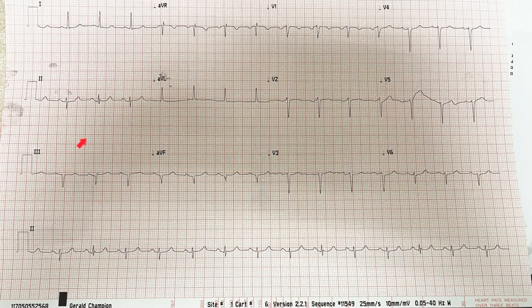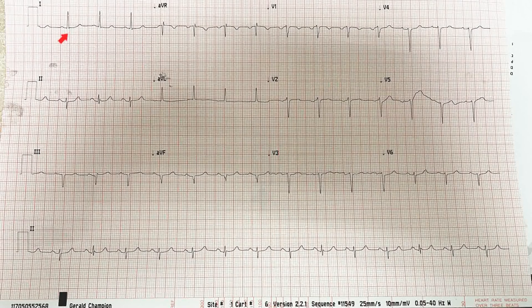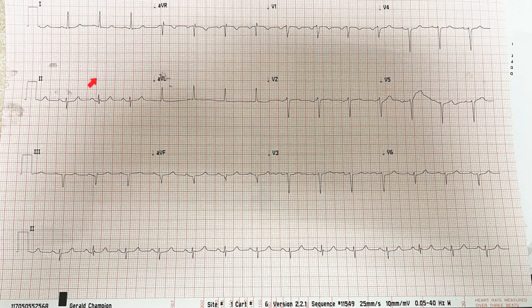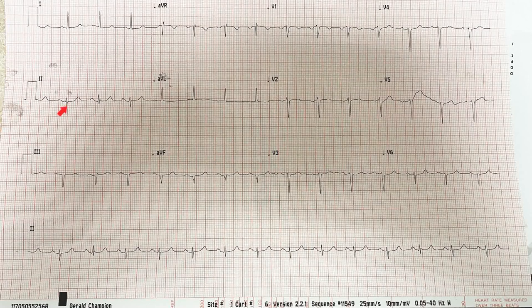I'll use the manual method: between the R intervals there are almost three and a half boxes, so the rate is around 80 — the patient is neither tachycardic nor bradycardic. For the axis, I look at lead 1: there is an upright, positive QRS in lead 1 and a negative QRS in AVF, so this is left axis deviation. Whenever I see left axis deviation, I immediately look at lead 2 — if it's negative, then this patient has a left anterior hemifascicular block. Left axis deviation with negative lead 2 equals left anterior hemifascicular block.